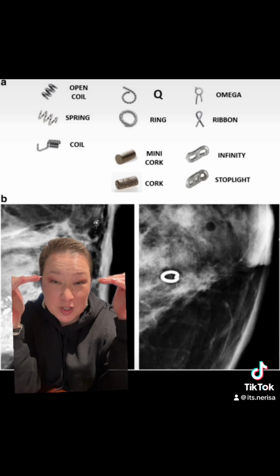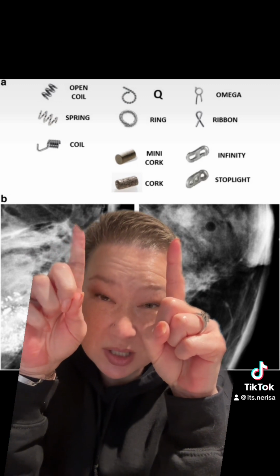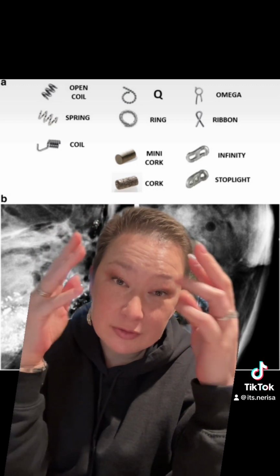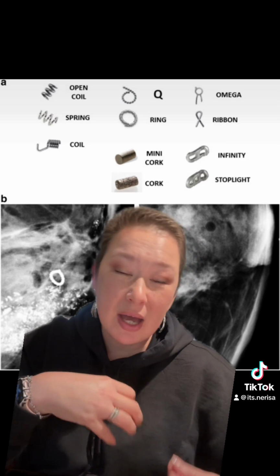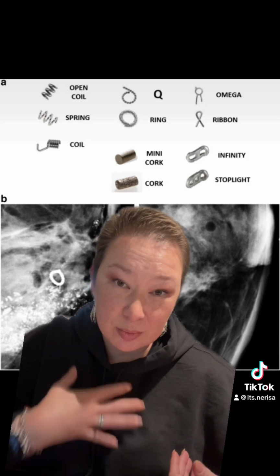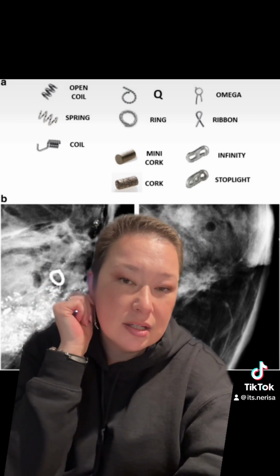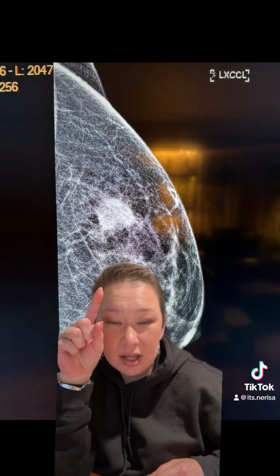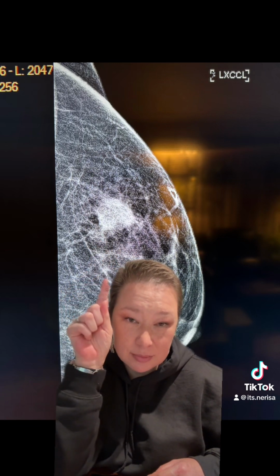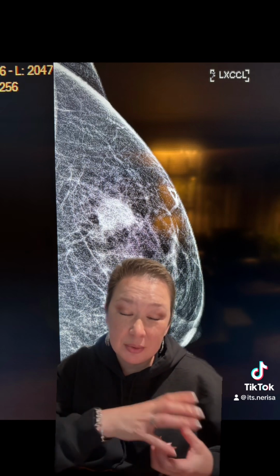So this half of this picture is not mine. I just pulled it off of the internet. What I wanted to show you guys was this portion up here. They have a different variety of markers available so that they can differentiate between different spots. If you have different questionable areas in your breast, they will mark them with different markers so that they can tell them apart. And then during my lumpectomy, they went in and cut out the cancer bed and removed that marker, so it's no longer there. That also lets the surgeon know that he is in the proper spot when they've got the marker.